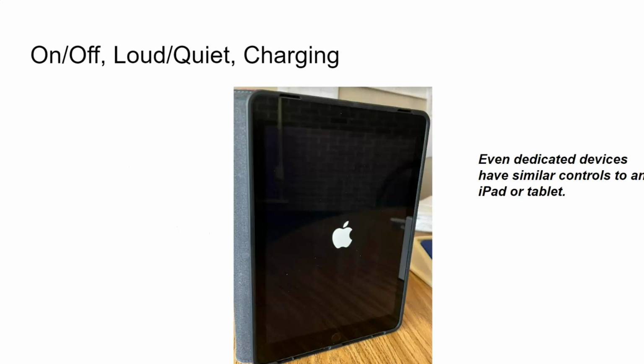Since most of us have some kind of smart device in our lives or in our pockets, these things are pretty intuitive. Depending on the version of your tablet-based device, there will be a switch to hold down to turn it on, as well as off, and some volume buttons. Some programs have buttons built in within the software where the user can make adjustments, though the outside buttons work well for others. I use them sometimes to help a student talk quieter or even whisper at times.